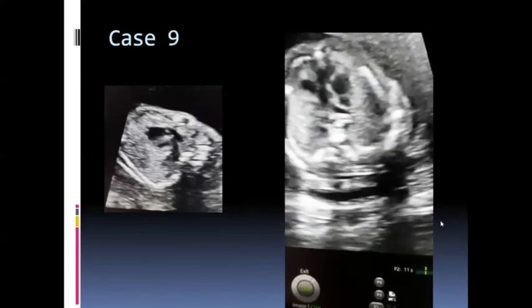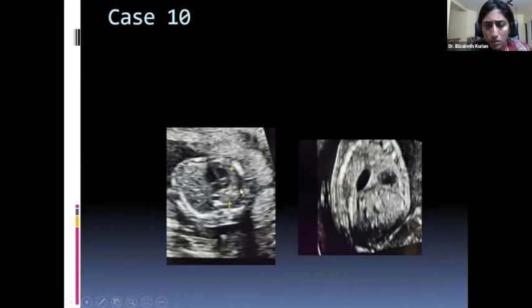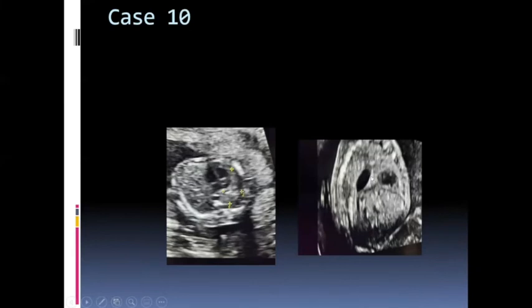So here, this is the diaphragm. What is happening here? This is the heart. Yeah, it's a diaphragmatic hernia, and the stomach has gone up. So what I have measured here is the normal lung, and that is how you calculate a lung to head ratio. LHR has to be calculated because that will help in the management.